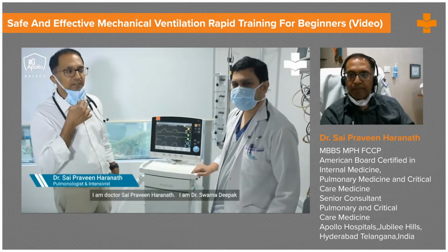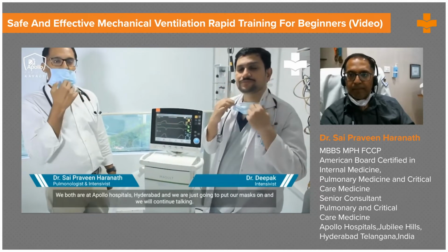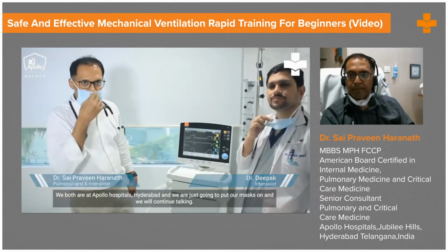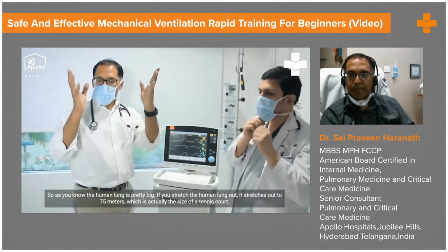I am Dr. Haranath. And I am Dr. Swarna Deepak. We are both at Apollo Hospitals in Hyderabad, and we're just going to put our masks on and we'll continue talking. So, as you know, the human lung is pretty big.